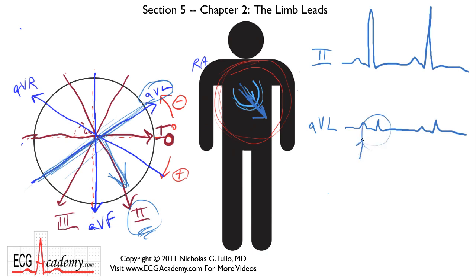The monitor may actually double count the P and the QRS, or it might not pick up anything at all, and you'll get heart rates of 0, and that makes the patient's family really upset when they look up at the monitor and see heart rates of 0. Because the monitor is not picking up the QRS complex. So switching to a lead that will pick up a larger signal makes a lot of sense in those cases.